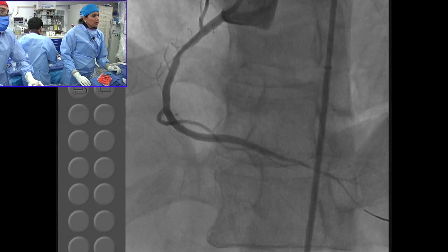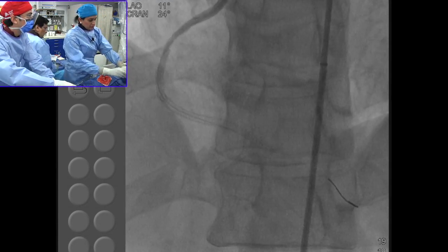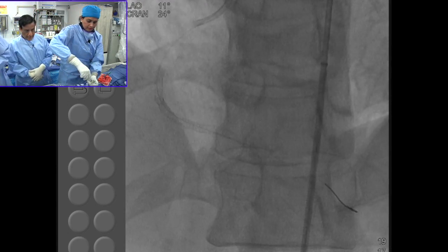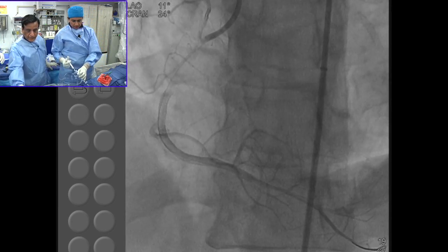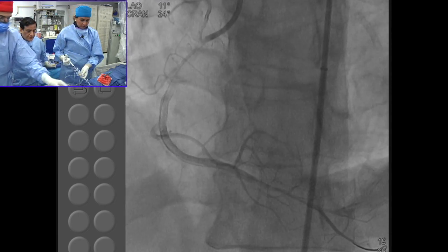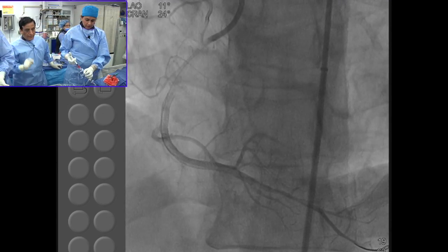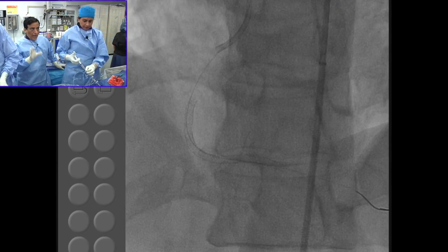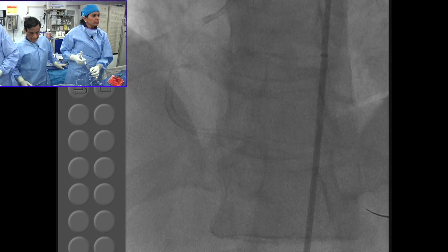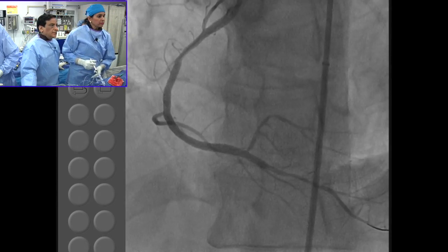Let's start giving a little verapamil, because many of the side branches start occluding. It started coming back already. The plaque shift and so on. You can always do what I call a liquid stent by giving maybe 2B3A. Every trial of the 2B3A did show that it is associated with a lower side branch occlusion. Many times in these cases you plan not to go through the stent struts, because you will distort it. That area where you do a dilatation through the stent struts comes back with restenosis. So if you can get away, because this is largely plaque shift and a little thrombus which will clean out by itself. The vessel has started coming back quite well. And probably even removing the guide wire will further increase it. There you go, it's almost back.